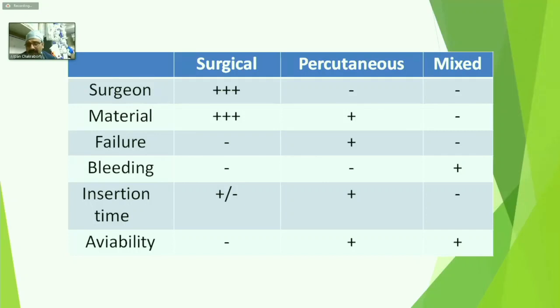So my take home is that ECPR should be done by a confident person who is doing regular cannulation, and the cannulation he is doing regularly on his own should be the prime method of cannulation at that point of time.